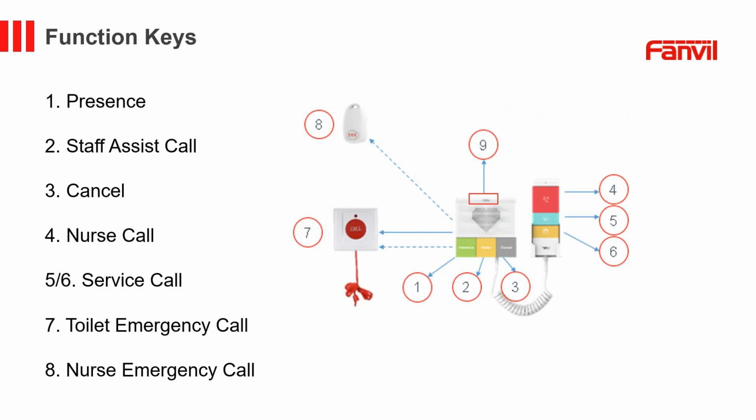The function keys on the nurse call cell phone, such as presence, nurse call, toilet emergency call, and nurse emergency call, provide access to frequently used features. These can be customized to suit the needs of the healthcare facility. So there are many function keys.